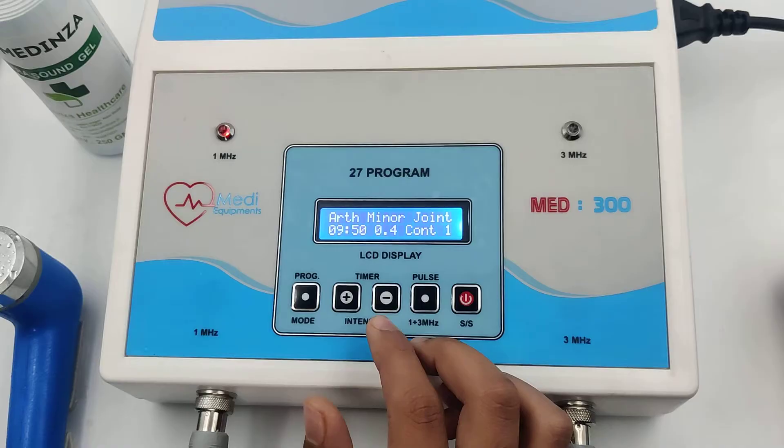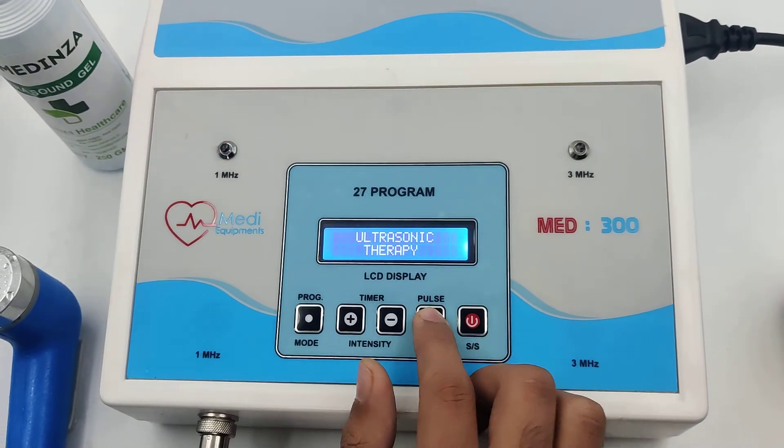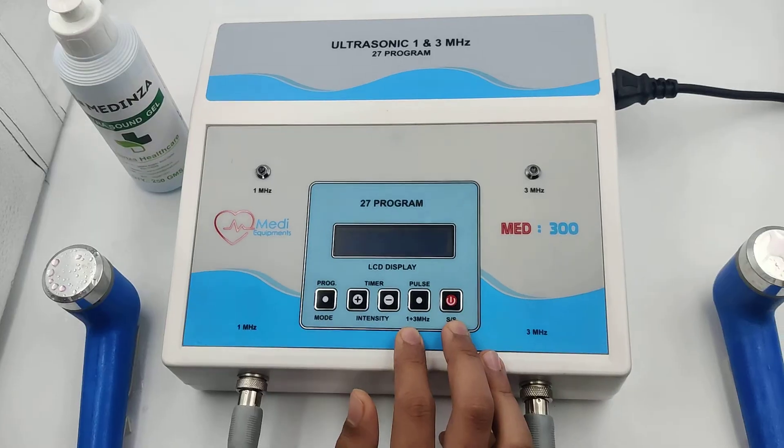Now you can shift the current from 1 MHz to 3 MHz. After treatment is completed, stop the machine and switch off the machine. The demo is now completed.